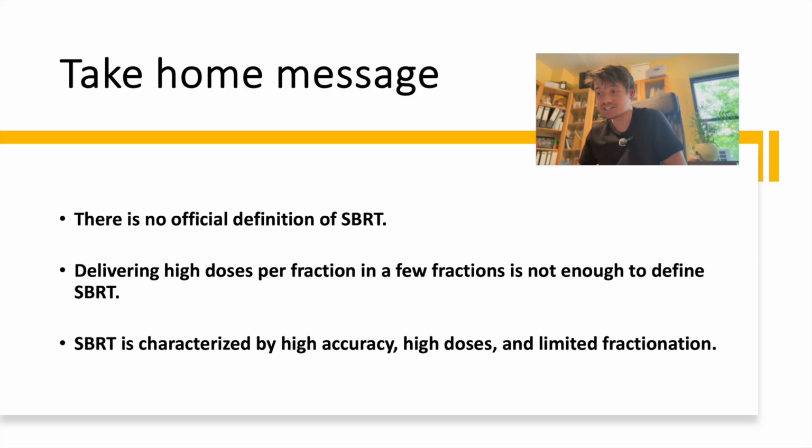Take home messages: there is no official definition of SBRT. Delivering high doses per fraction in a few fractions is not enough to define SBRT. SBRT is also characterized by high precision, high accuracy.